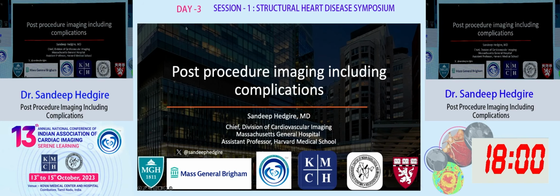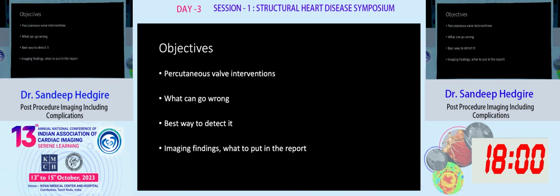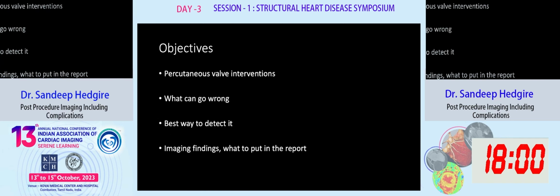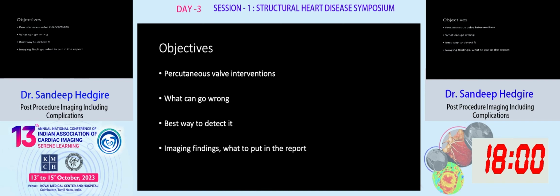All right. I feel like this morning you're going to have a Sandeep overdose. So my next talk today is post-procedure imaging, including complications. We're going to see what are the percutaneous valve interventions and what can go wrong during those interventions, best way to detect it, and we'll gather a lot of imaging findings as we go through these cases.